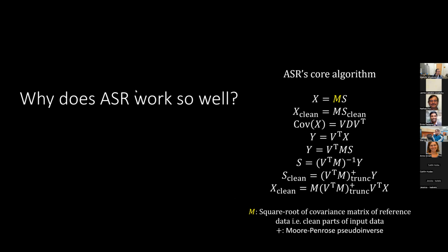I can explain the technical aspects of ASR, but I'm not going to go into that now because I'm running out of time. But one thing I want to mention is that even though ASR is known to depend on principal component analysis, it's not the simple sliding window PCA rejection, because PCA is a part of ASR, which is y equals V transpose x here. But the final mixing matrix is here, which is actually learned from the clean part of the data itself. So it's not PCA per se, but a mixture of PCA with the help of the clean part of the input data itself. So that's why it's kind of smart.